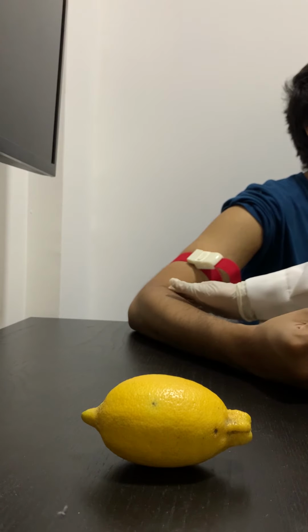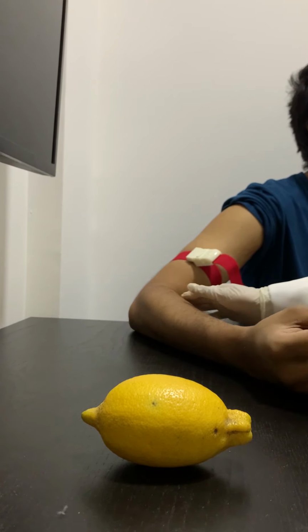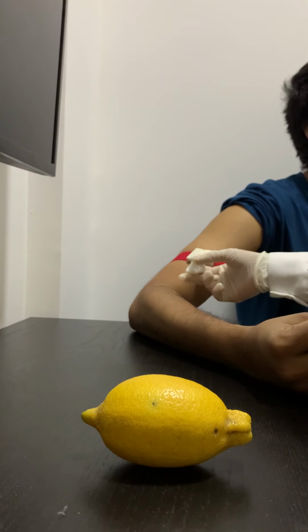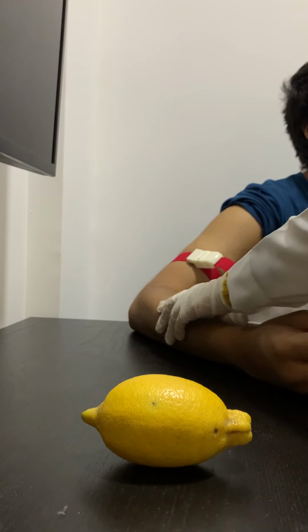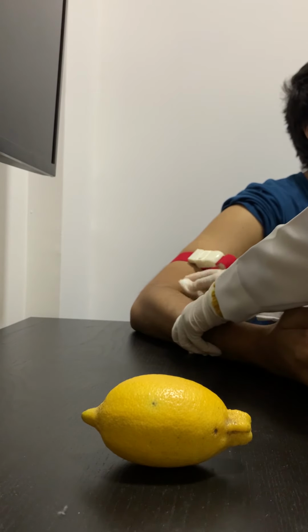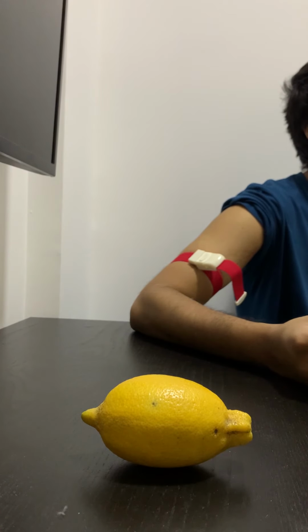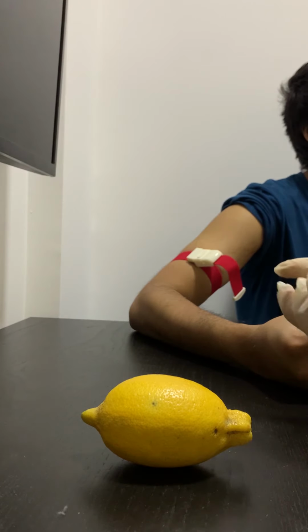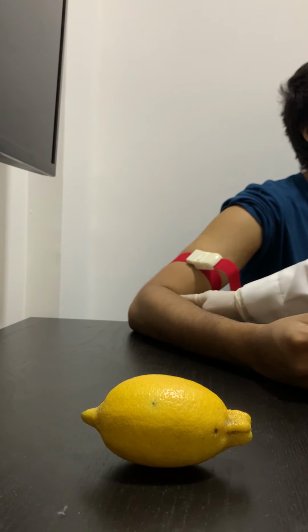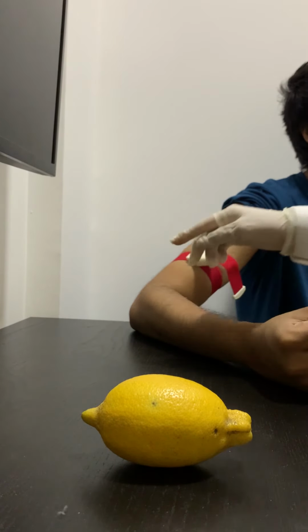So we should palpate and then find the position, and then we must clean the area of the injection site with antiseptic solution. After cleaning the site of injection, we can ask the patient to again clench and unclench the fist, and then we can fixate the vein to prevent it from moving during the injection.